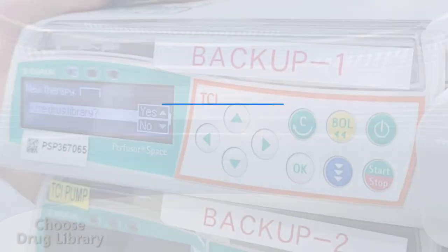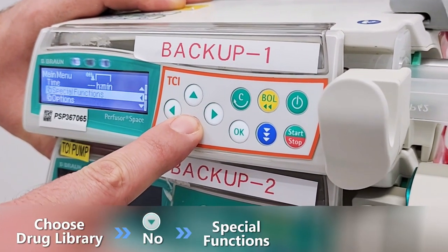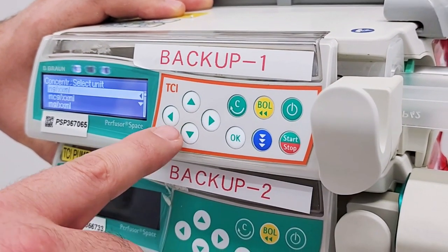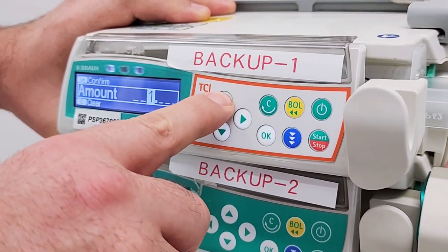To choose dose rate calculation, select no. Then scroll down to special functions and select dose rate calculation. Select the unit and confirm it. Enter the concentration of the medication by entering the amount and the volume, then confirm.